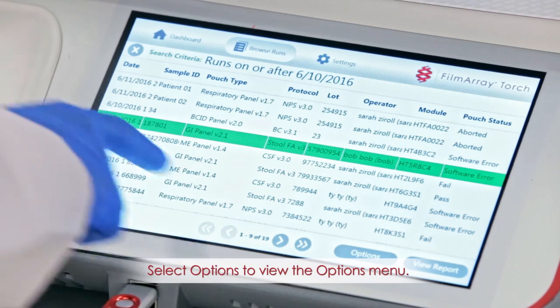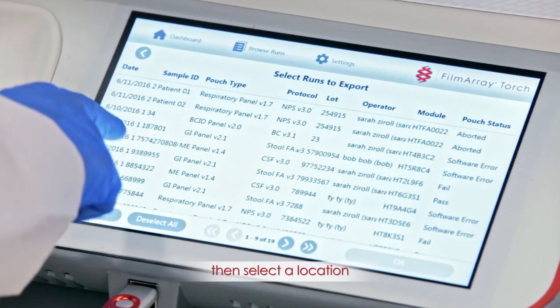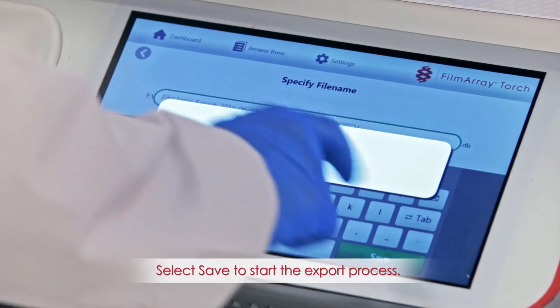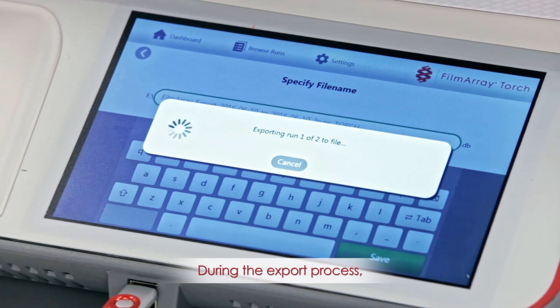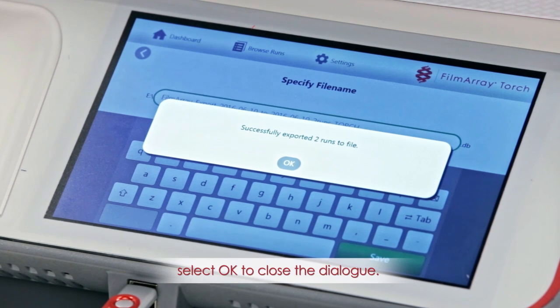Select Options to view the Options menu. Select Export Run, then select a location and file name for the .db file. Select Save to start the export process. During the export process, the Export Runs dialog will display the progress of the runs being exported. When the export is complete, select OK to close the dialog.